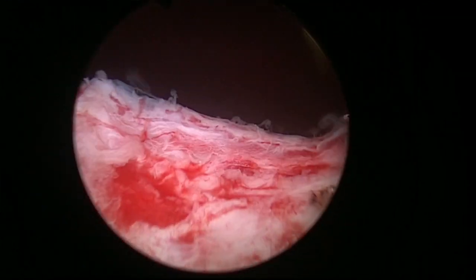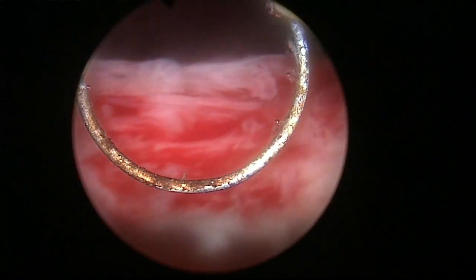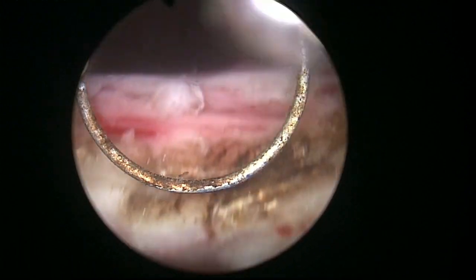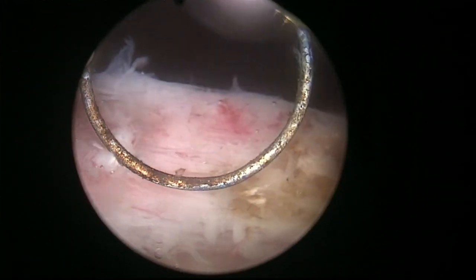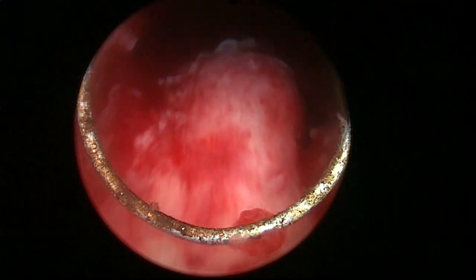Yeah, but you know the adenoma grows on the trigone and behind the trigone, and you know this patient. What time is it now? It's 7 or 8 p.m. Tomorrow morning at 8:30, something like that, the catheter will come out, and he will go home. And I don't think you can do a TURP that is so anatomic.